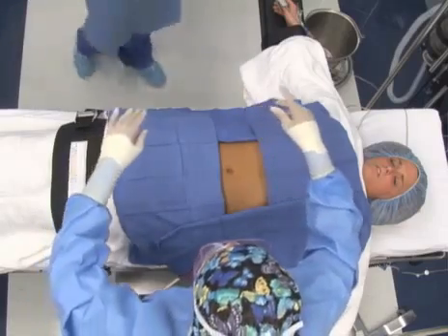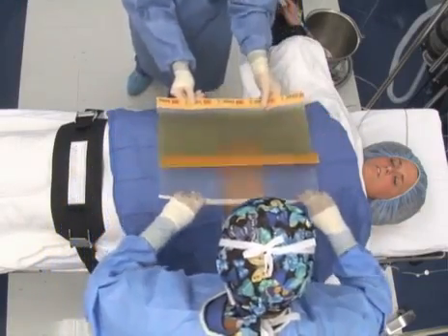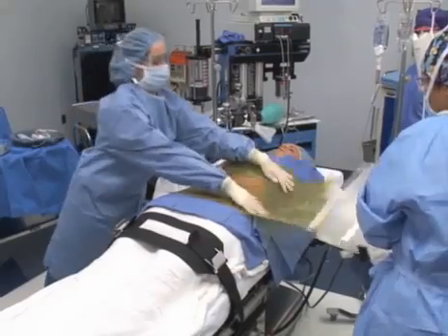The plastic incise drape is commonly placed over the entire surgical site on top of the towels and any bottom sheets and towels which form the fenestration or opening for the incision. The sterile incise drape is coated with adhesive on one side and may be impregnated with antiseptic. The drape is packaged with a paper backing on the adhesive side. The whole drape, including paper backing, is then folded lengthwise and contained in a plastic sleeve wrapping.